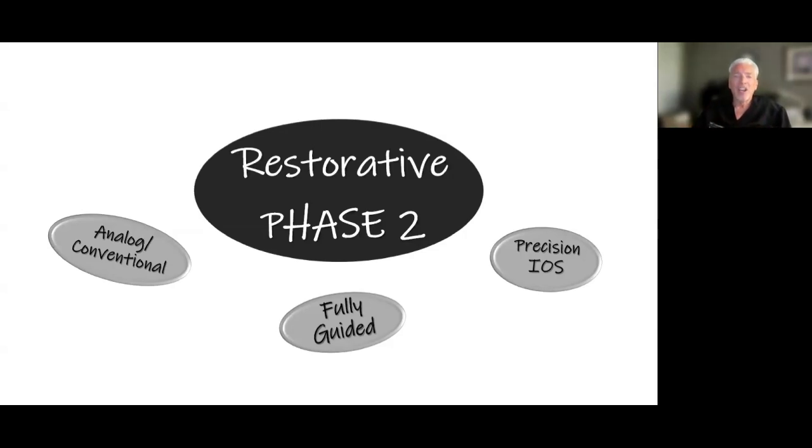How are you going to incorporate the scanning in your day of surgery? There'll be a lot of scans. It's not just 1 or 2 scans. Sometimes you're looking at about 5 scans on the day of surgery. Nothing wrong with that. Just don't want you to be surprised about it, but be aware of that.